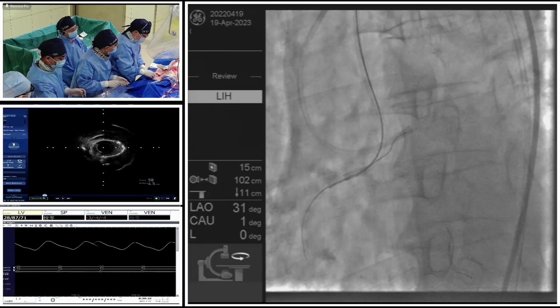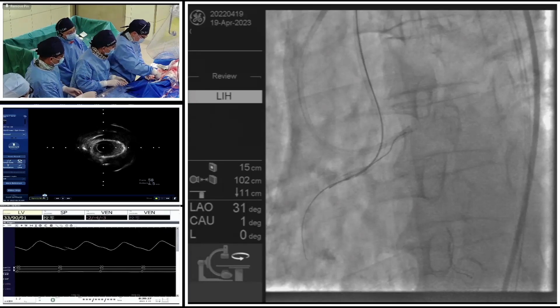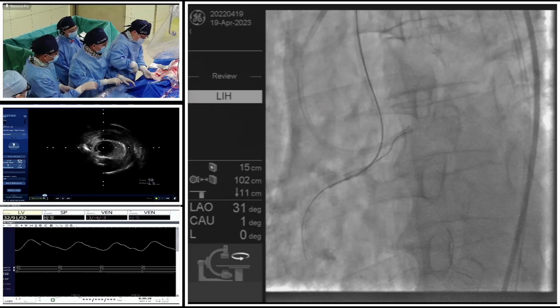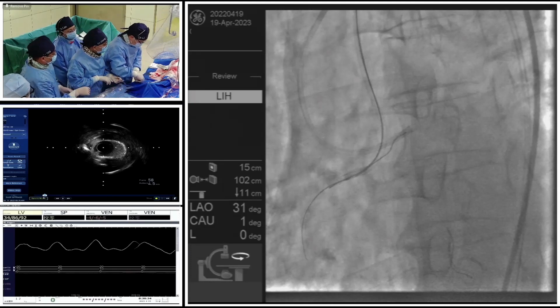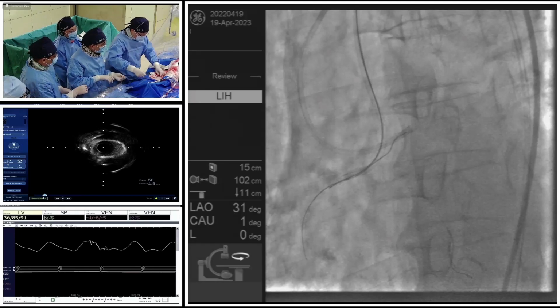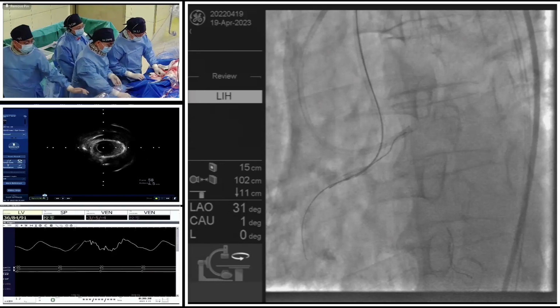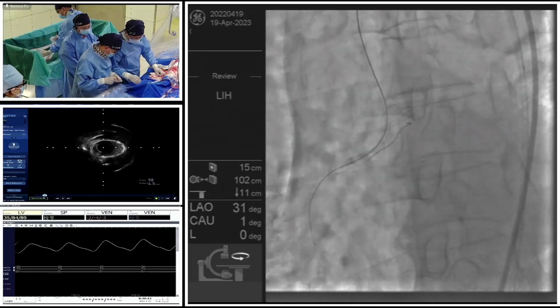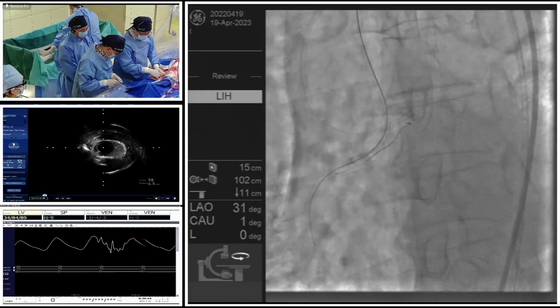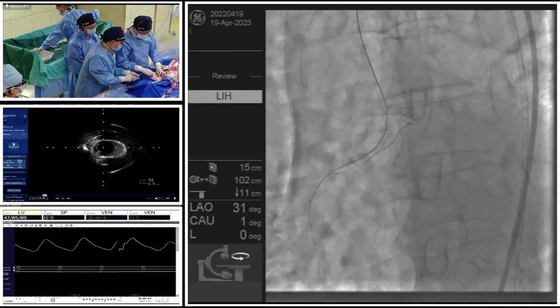Just like Dr. Lee in the introduction, I'd like to emphasize that this 3D CTA reconstruction software possesses proprietary intellectual property rights, which means that this software is 100% China-made. So this is our pride.